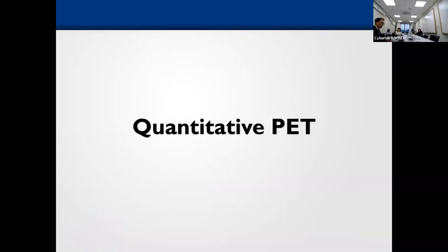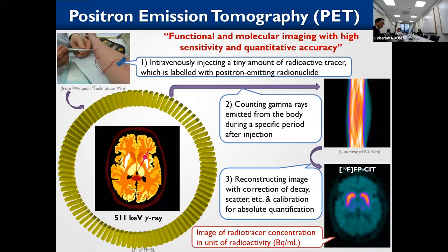At first, I want to talk about the quantitativeness of PET images. So you are all NM physicians who are familiar with PET images. And I understand Professor Jason Lee already provided a lecture on the principle of PET and the scanner machinery. So, let's briefly look into the principle of PET.